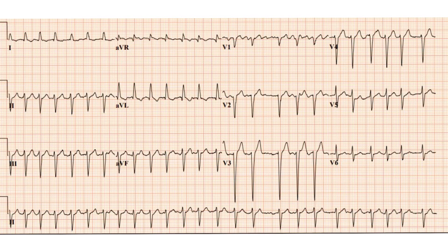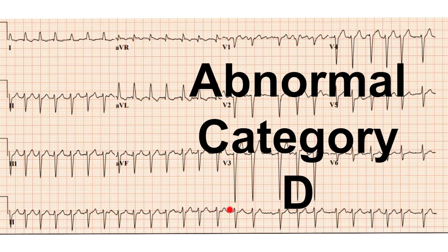The third EKG is also clearly abnormal. The main reason is tachycardia — the rate is very fast. Without going into details about the exact rhythm type — whether sinus tachycardia, sinus arrhythmia with tachycardia, atrial fibrillation, or flutter — this is an abnormal EKG from the first glance.